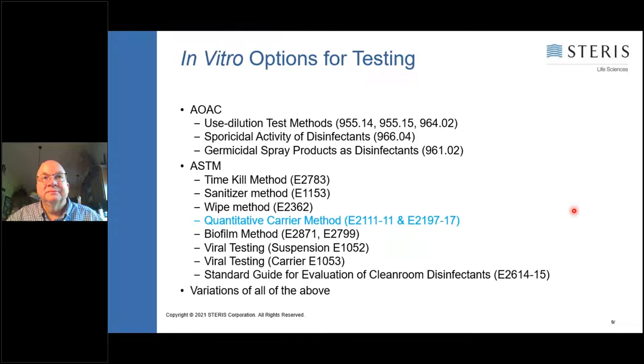And then there's lots of test methods out there. So before I get deep into these test methods, I want to mention, when you look at a couple of the recent 483s and warning letters by the Food and Drug Administration, you can see how really important having a good, sound cleaning and disinfection program is.